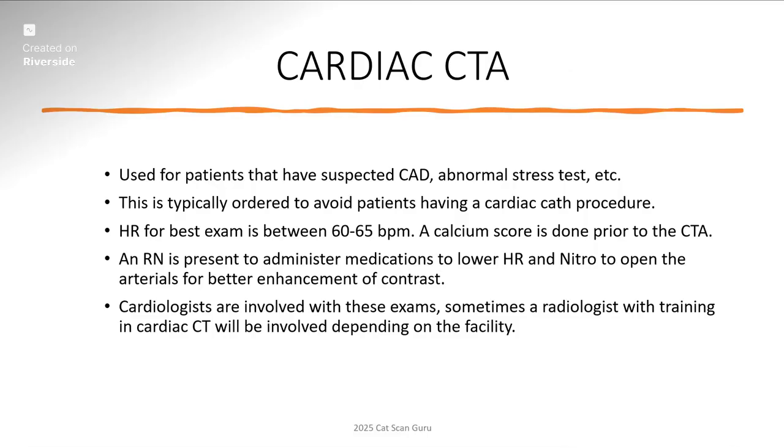Now, there was an instance where I did have just a radiologist present. I worked at a facility where this radiologist was trained in cardiac, and he administered all the medications and was there for the entire scan. This radiologist was great because he did his own workups too. So all we had to do was the scan. That's it. Start the IV, make sure that the patient took the lopressor, because it was oral lopressor, before they got on the table with the radiologist present. And I mean, it was like the easiest cardiac CTAs we ever did. But normally cardiologists are the ones that are involved with these exams.